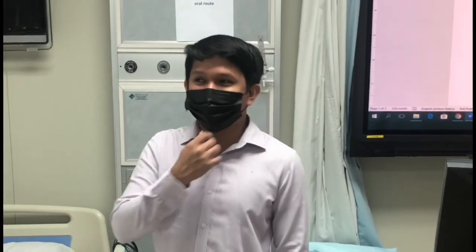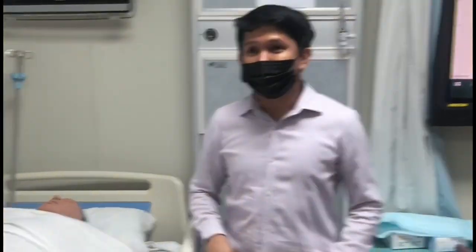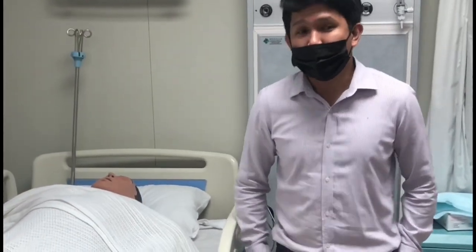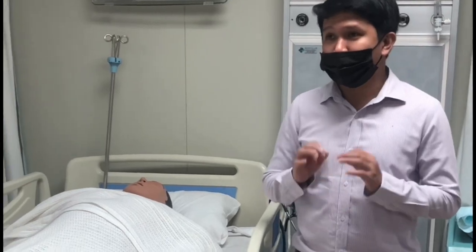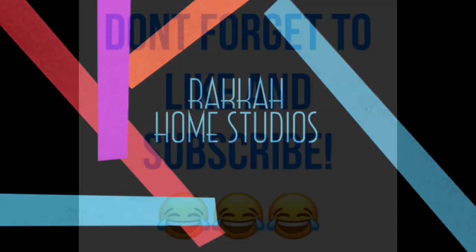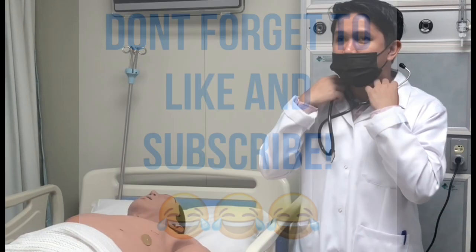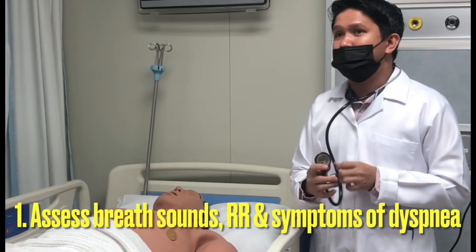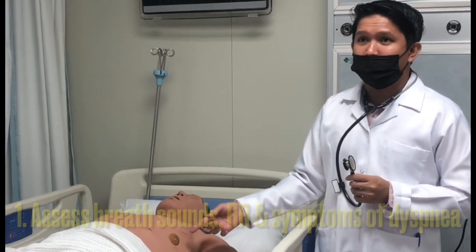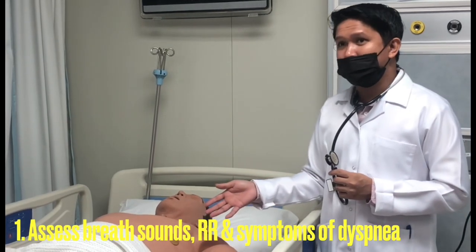For oxygen therapy, we give oxygen to the patient based on the doctor's order. One of the goals is to reduce the workload of breathing and to reduce the stress of the patient, by counting the respiratory rate and breath sounds of the patient and observing if the patient is having some symptoms of dyspnea or difficulty of breathing.